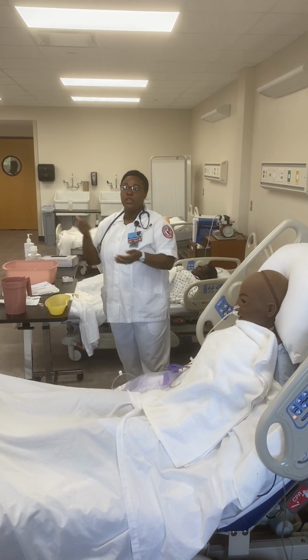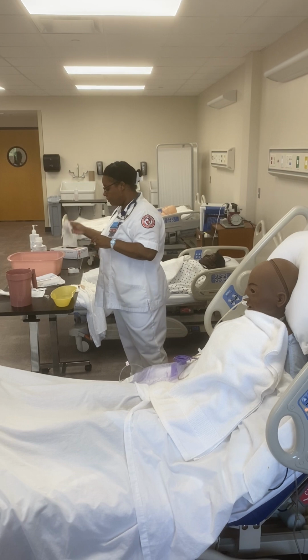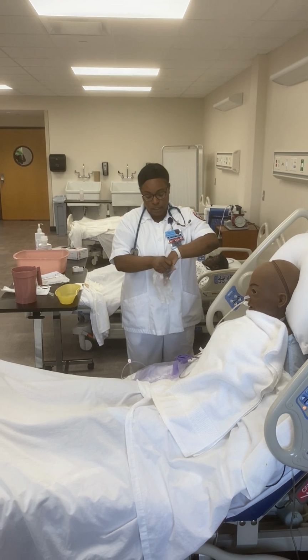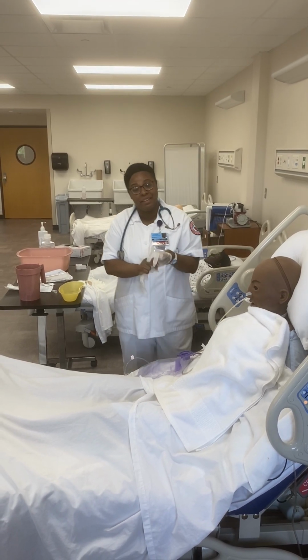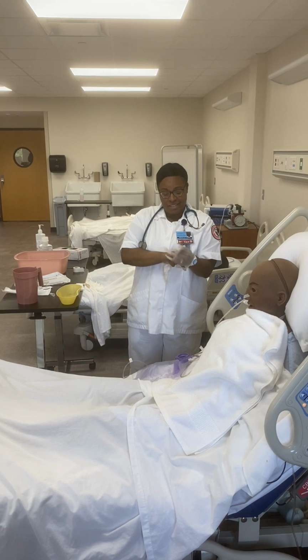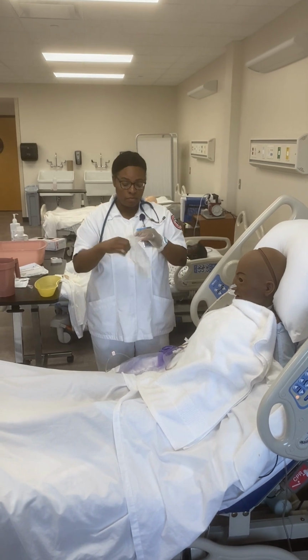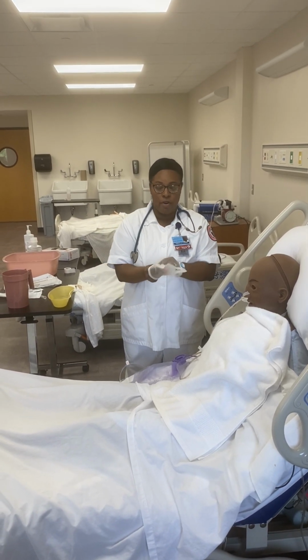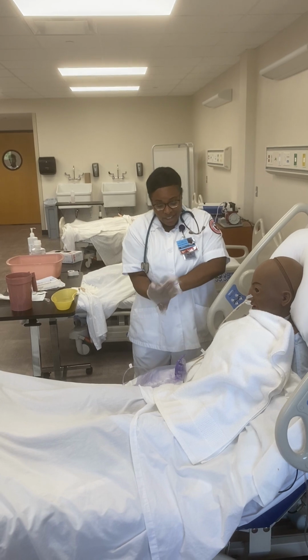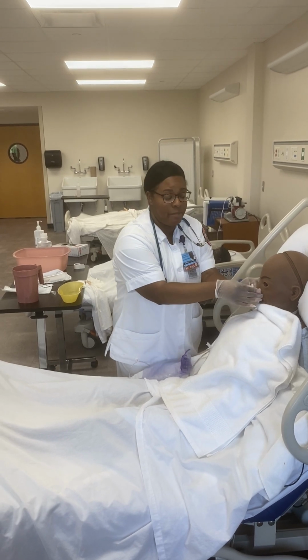Now going into the discontinuing of the NG tube, I'm going to verify my physician's orders, perform hand hygiene, don clean gloves. In real life, I would pick that glove up right there and discard it in the trash. But for video purposes, we're going to go on with the procedure. Now, to discontinue the NG tube, I already verified my physician's orders. I verified my patient. Perform hand hygiene, I'm donning clean gloves. I'm going to, of course, have my patient up in high Fowler's position and remove my tape.